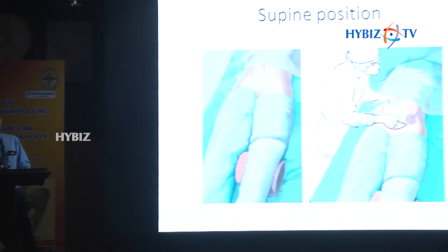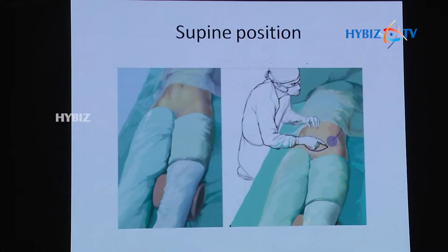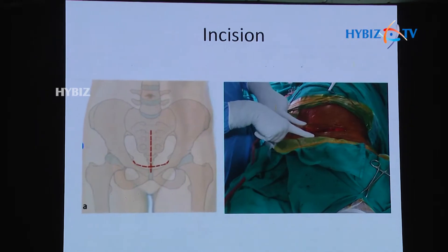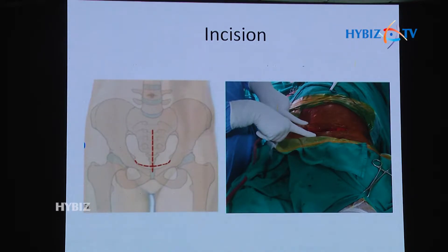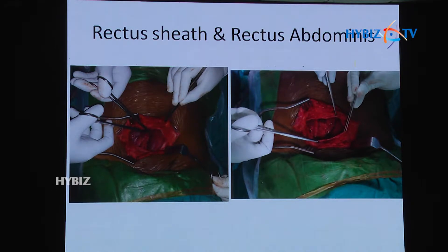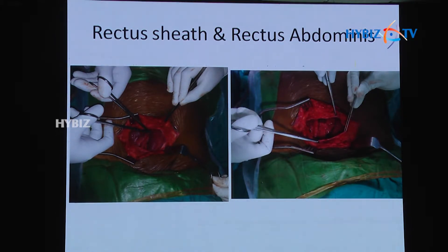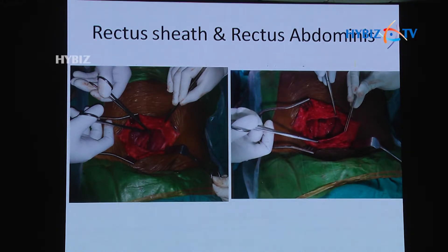In Stopa's approach, the patient is placed in the supine position with a roll below the knee on the operative side — this is very important to relax the anterior neurovascular bundle during dissection. The surgeon stands on the opposite side of the fracture. The incision is a Pfannenstiel-type incision placed two centimeters above the pubic symphysis. The skin and subcutaneous tissue are dissected, the anterior rectus sheath is retracted, and the rectus abdominis muscles are visualized.